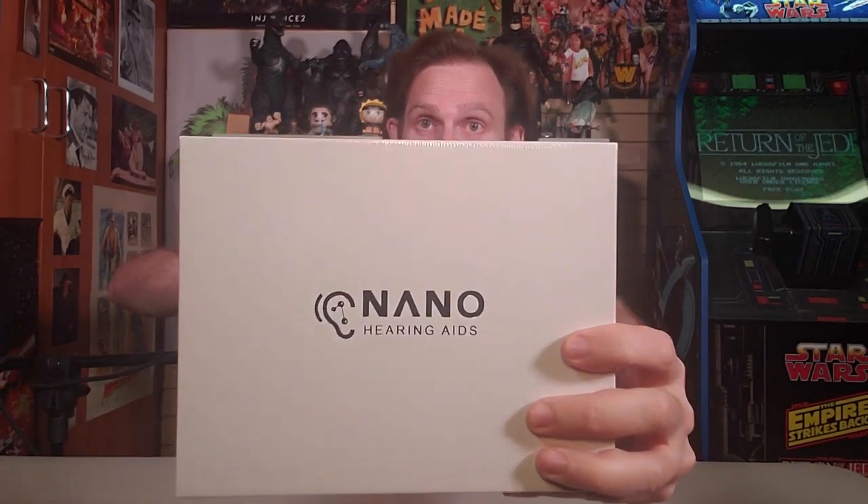On this episode of Scott vs. Box, I open up Nano Hearing Aids, sent to me by Nano Hearing Aids. Oh man, hearing aids are the best. They get you out of any boring conversation. Tell me more about the surgery on your elbow.